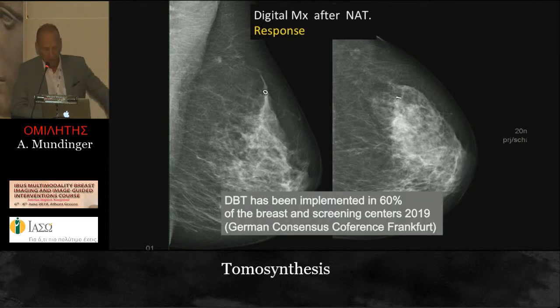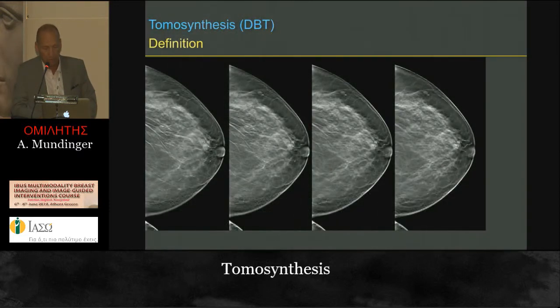Today in Germany we have implemented DBT in nearly 60% of breast centers, radiological departments and private practices, and it's the same rate for the USA.